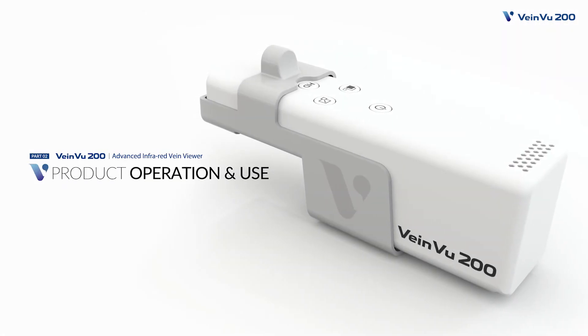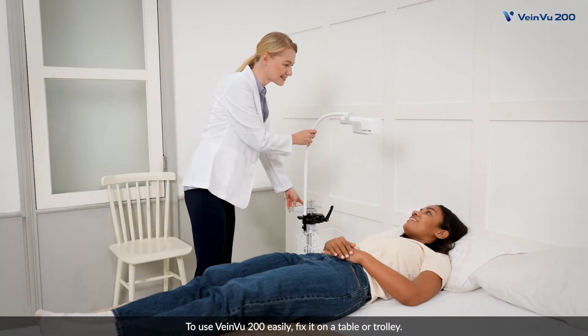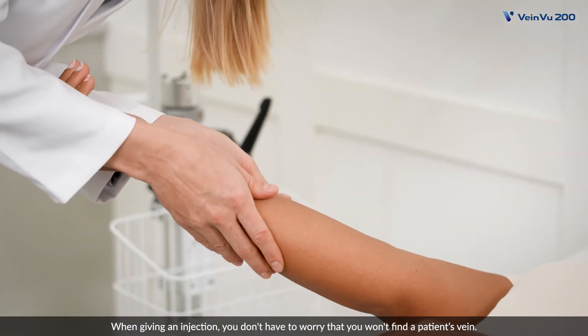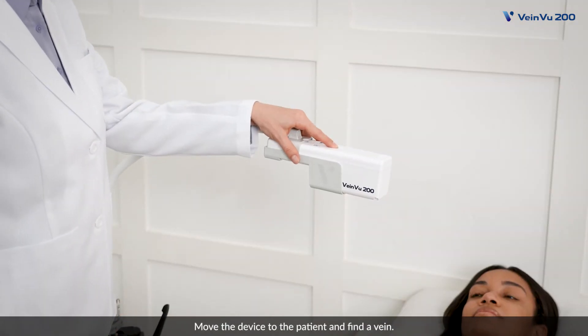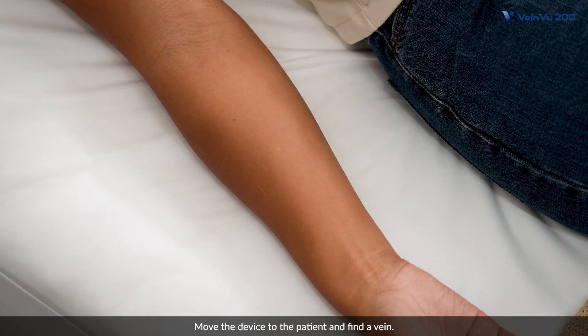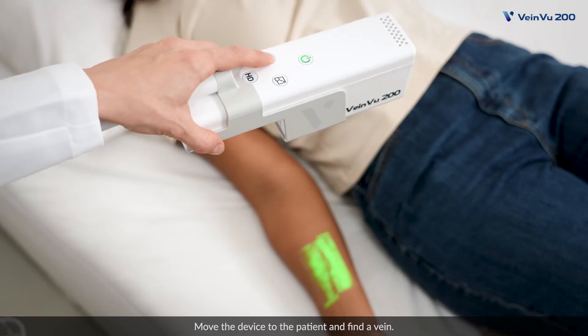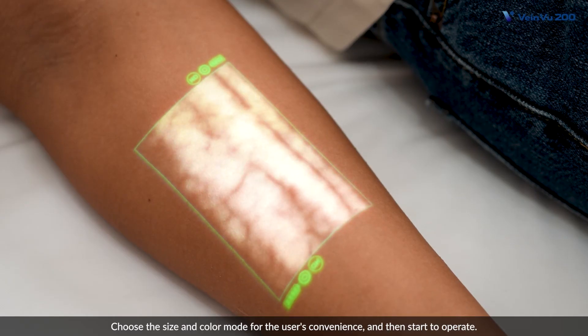Product Operation and Use. To use VeinVu 200 easily, fix it on a table or trolley. When giving an injection, you don't have to worry that you won't find a patient's vein. Move the device to the patient and find a vein. Choose the size and color mode for the user's convenience and then start to operate.